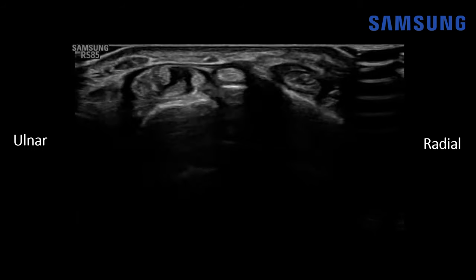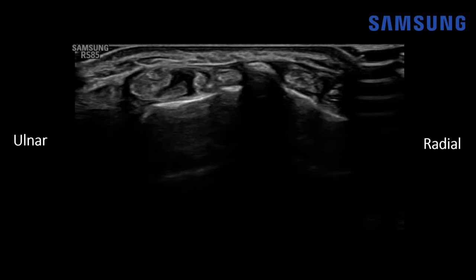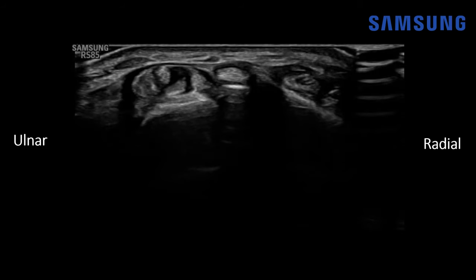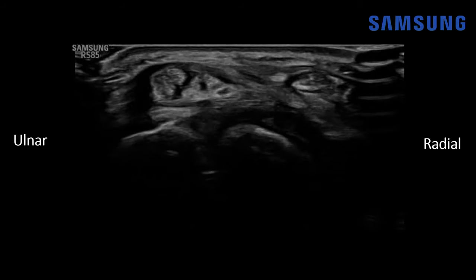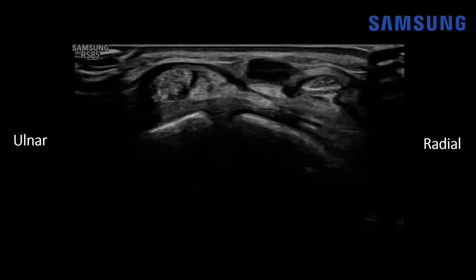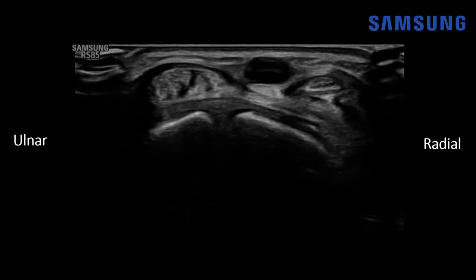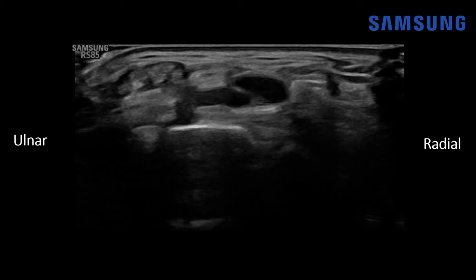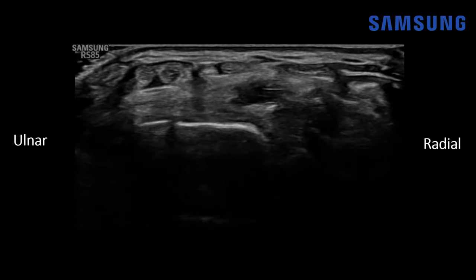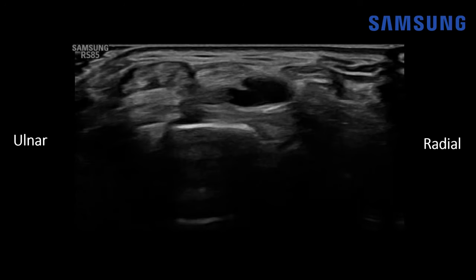But back to the cystic focus at hand in this case. We've moved back to Lister's tubercle as our home base landmark. Now we're moving distally, and we can see that the cystic structure appears in between the compartment four tendon sheath and the compartment two tendons. As we go more distally, notice how it dives a bit more deep, and we can even see it has this serpentine configuration extending towards the joint space — a useful feature for the surgeon to know where it may be coming from.